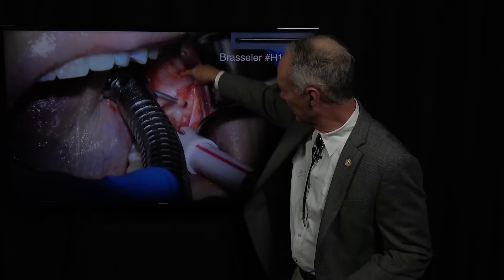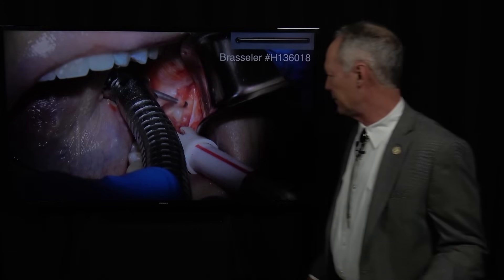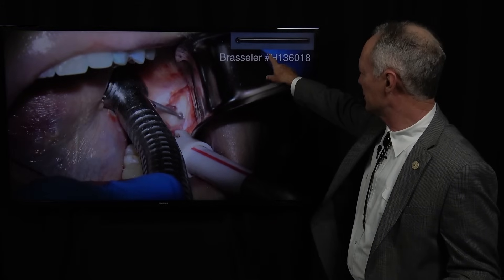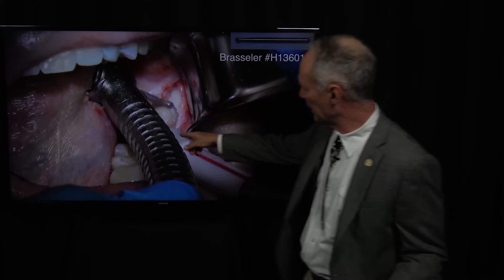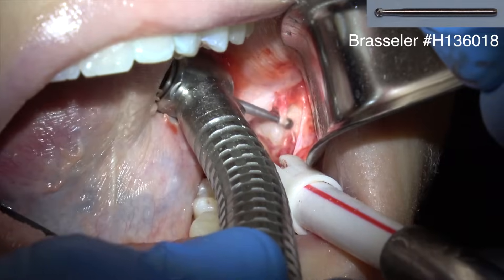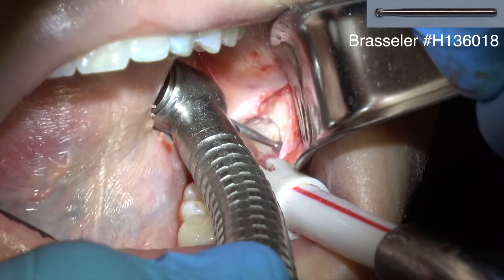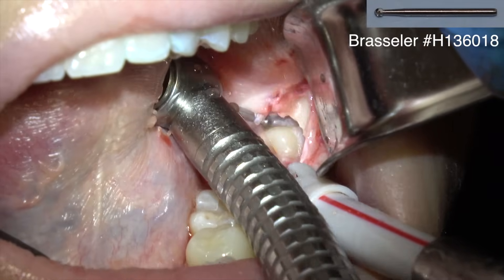And I'm making a cut in the bone and the tooth on the buccal aspect. And this is just a long shank brazilier round burr. You can see how I'm cutting a trough here on the buccal aspect of the tooth, extending it to the distal of the tooth.